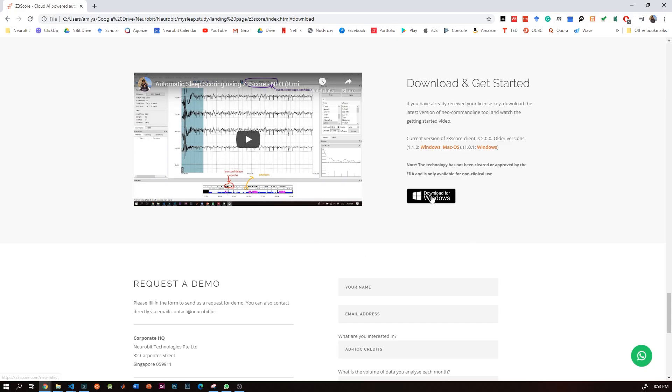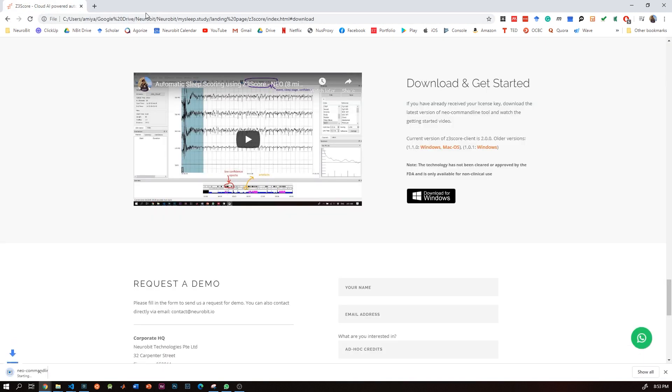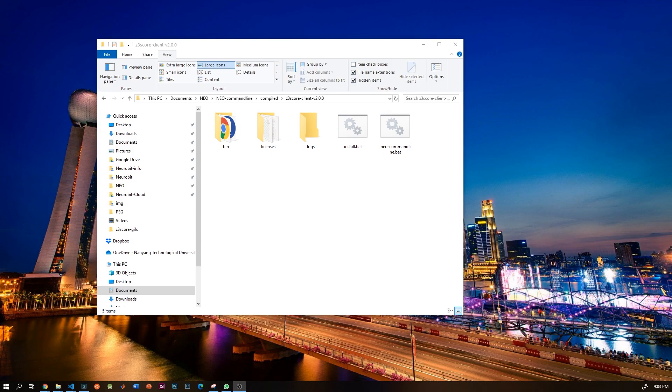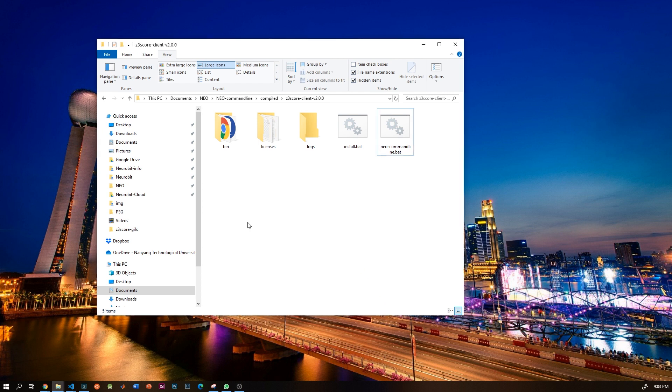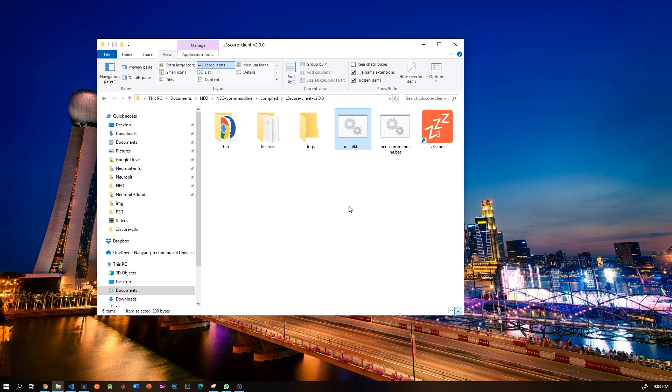Let's download z3score first from z3score.com and extract it. I have already done that. To install, just click the install icon and it will install the app on that folder as well as on your desktop.